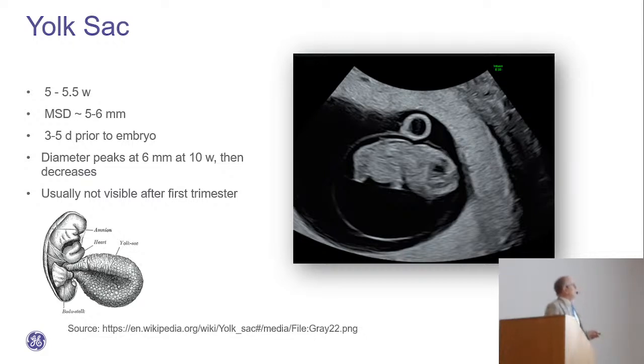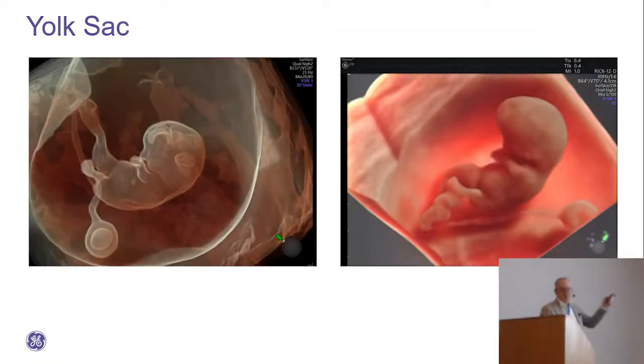So then you see it over here. I'm just pressing the wrong button. Look at the images you can make. Just make this sweep. And then we also had a discussion about the use of HD Live with this nice flashlight that you can turn around. It really makes sense in this kind of images. So just try, because you have the probe. So just make 3Ds of the early pregnancy.